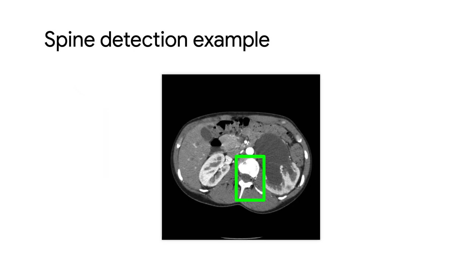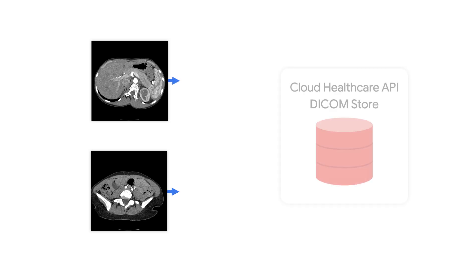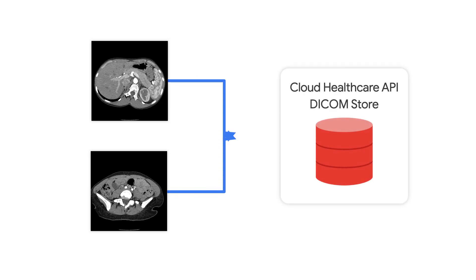Let's take a look at an example of how the Cloud Healthcare API can be used to build a spine detection machine learning model using a small set of DICOM CT images. First, images are ingested into a DICOM store. A data store is simply a place to store a certain type of healthcare data, so a DICOM store is a place to store DICOM medical images.